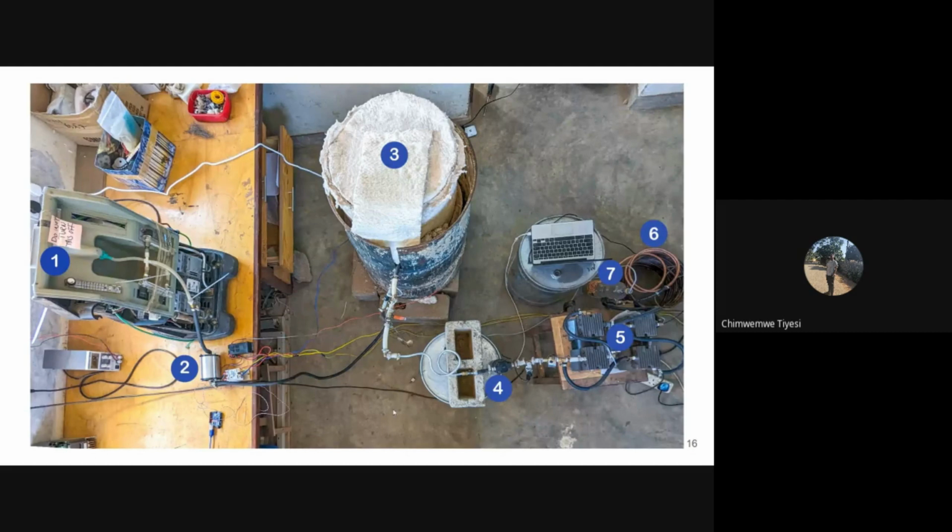We constructed an experimental jig, as you can see in the picture, numbered 1 to 7. This jig comprised a heating chamber which housed a removable airtight crucible within which zeolite was placed. Number 3 there is the drum where zeolite was placed inside a crucible. And number 1 is the dry air source, a modified oxygen concentrator. And we're heating it at 550.